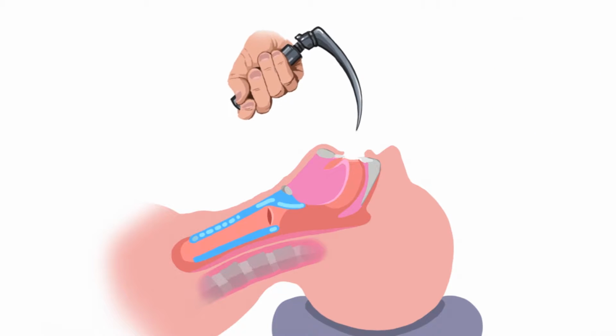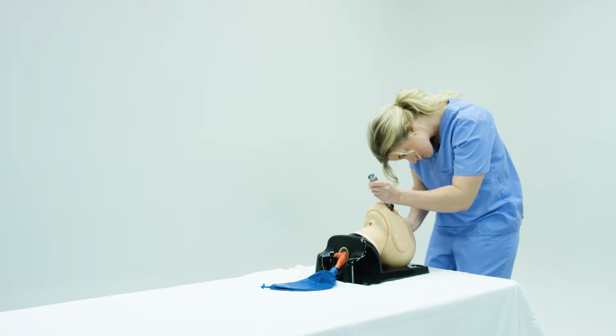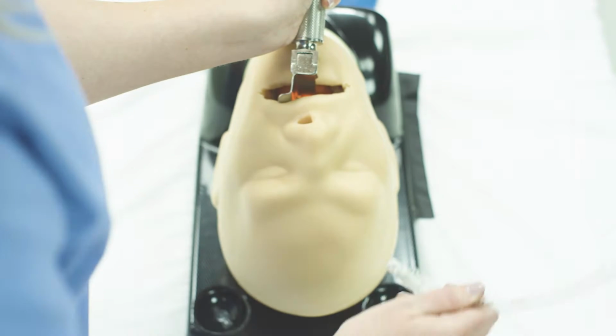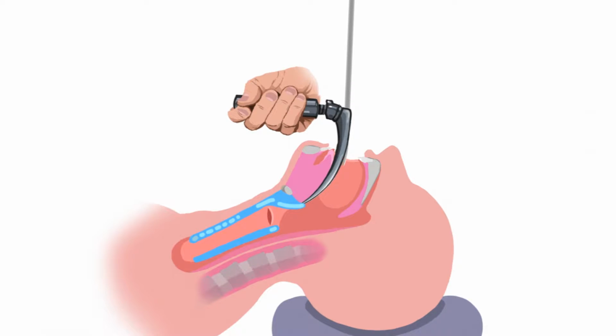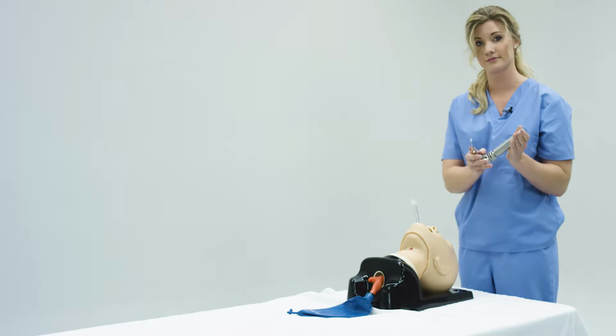Intubation using the traditional laryngoscope is performed by placing the scope into the mouth and directing the tip of the curved blade in front of the epiglottis to push the tongue forward. This movement is upwards and forwards. The user can then usually view the vocal cords and pass the endotracheal tube through the vocal cords into the trachea. The scope is then removed. This technique works the majority of the time.